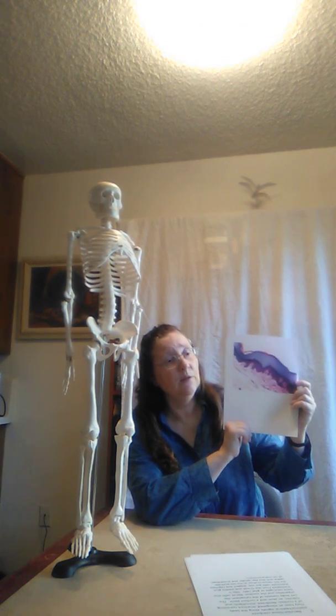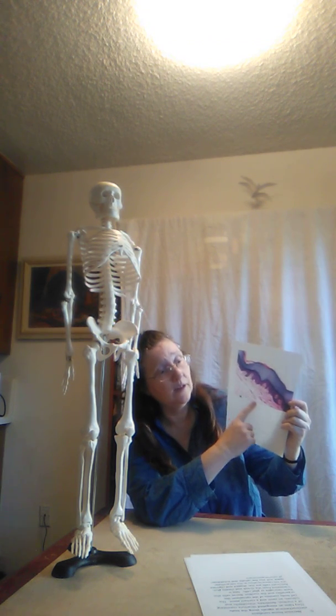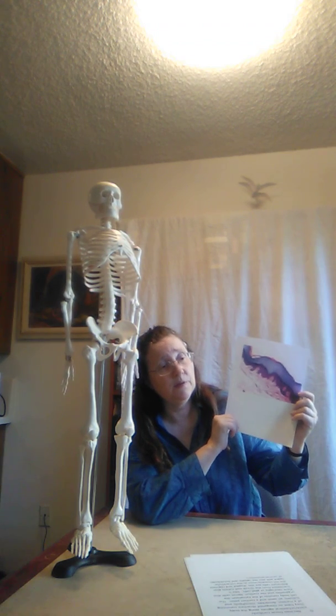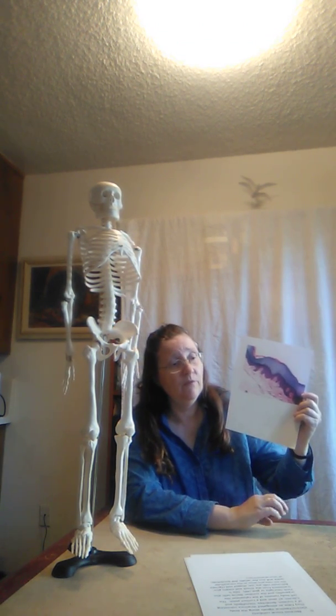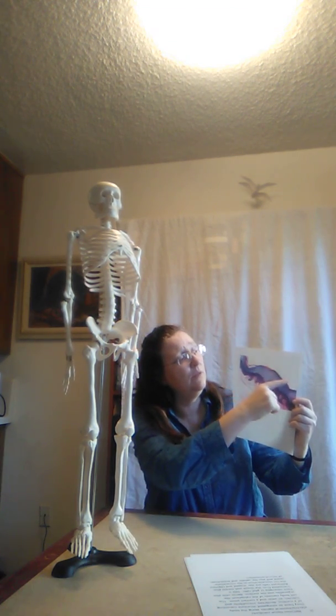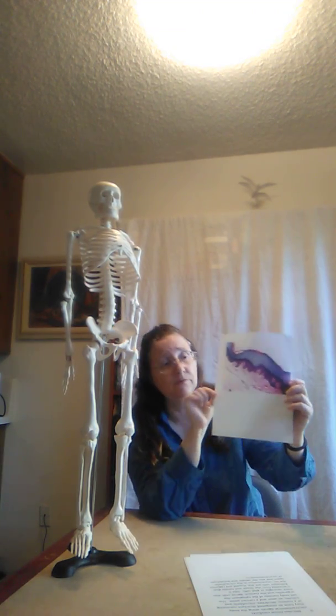There is a basal lamina which is composed of a mixture of glycoproteins and collagen. The basal lamina attaches to a reticular lamina which is secreted by the connective tissue below and connected at a basement membrane. Epithelial cells receive nutrients by diffusion from the underlying tissues. And actually in this picture you can see the function of dead skin cells at the top of the photograph.